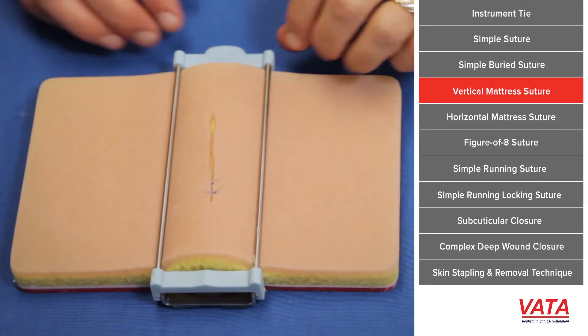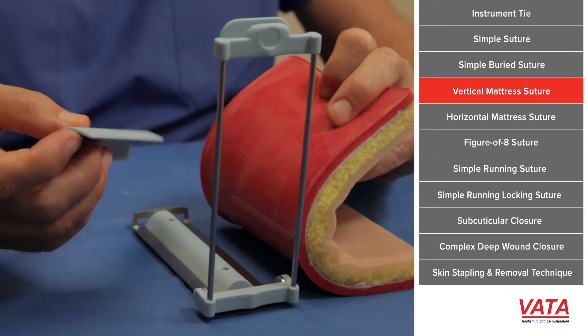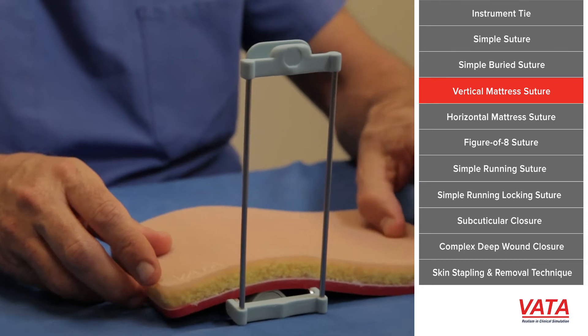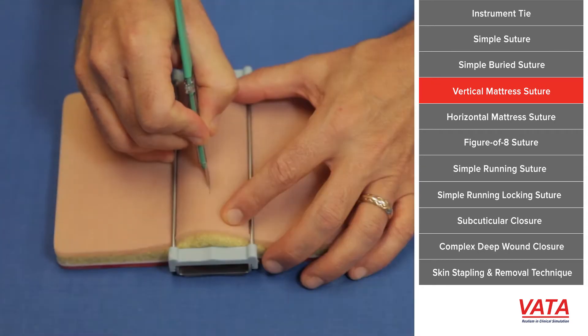Next, I'm going to show you a little more complex suture, the vertical mattress suture. Again, we're going to go ahead and open up the device that comes with your suture pad that helps to put tension on the skin.